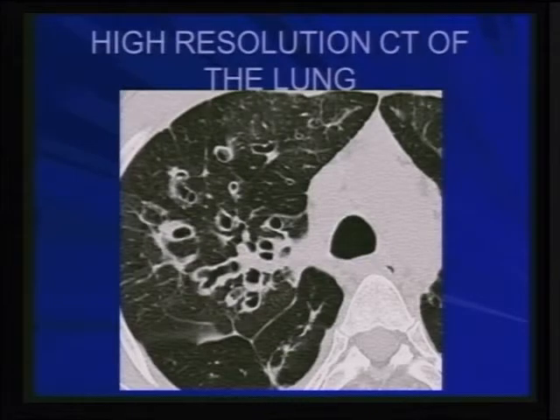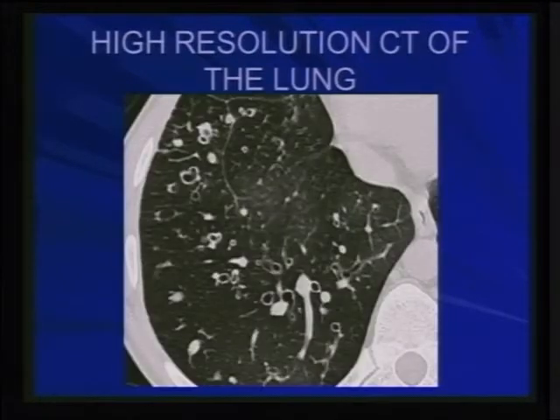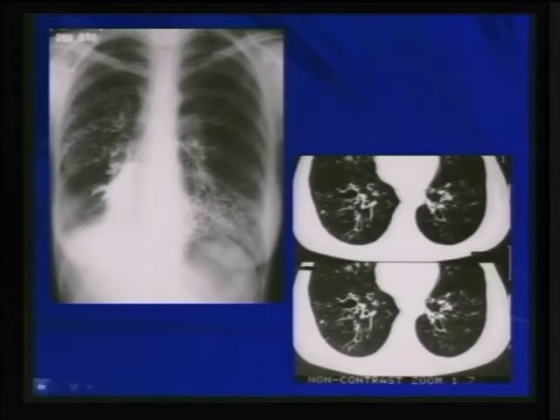And this takes me to another pattern recognition, which is the fact that we can easily recognize bronchiectasis with CT. We used to do this old and somewhat traumatic procedure called bronchography to make the diagnosis of bronchiectasis. But now we can recognize it on CT just by the fact that we can trace the course of the bronchus, but more importantly, we can see it's dilated in comparison to the accompanying artery. So if the bronchus next to the artery is the same size or bigger than the accompanying artery, that's the definition of bronchiectasis.